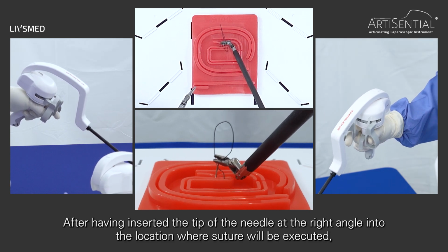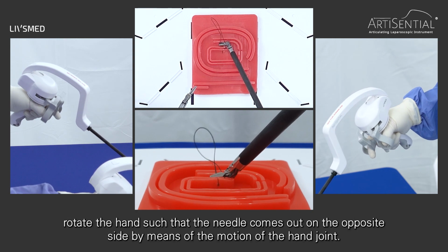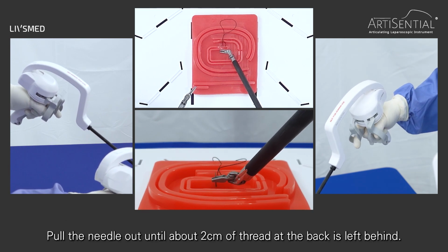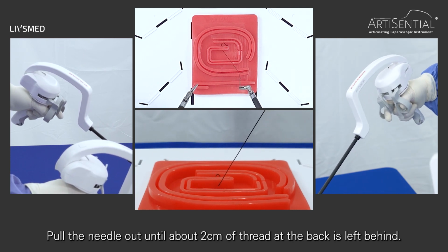After having inserted the tip of the needle at the right angle into the location where the suture will be executed, rotate the hand such that the needle comes out on the opposite side by means of the motion of the hand joint. Pull the needle out until about 2 cm of thread at the back is left behind.